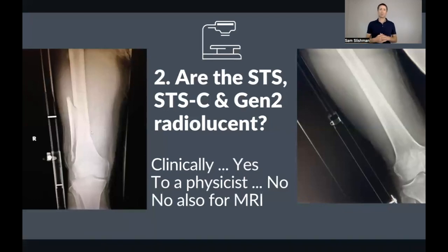All right, FAQ number 2, are the splints radiolucent? And this one gives me a bit of heartburn periodically, because I would like to say relatively radiolucent, because the only thing that's really radiolucent is outer space. But relative to bone, it's radiolucent.